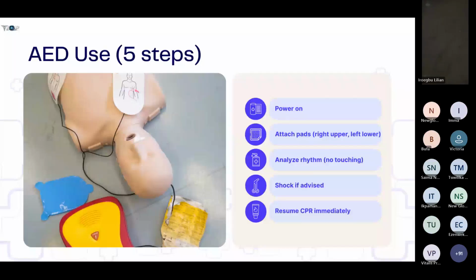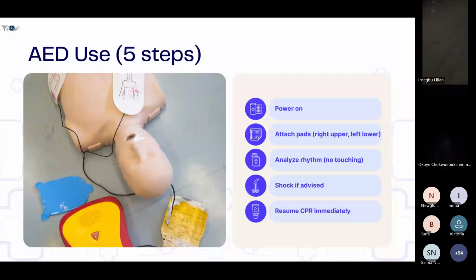Automated external defibrillator. Now, when you're using an automated external defibrillator in a case of cardiac arrest, the AED is like a best friend. So the first thing to do is to turn it on. When you turn it on, you attach your pads.